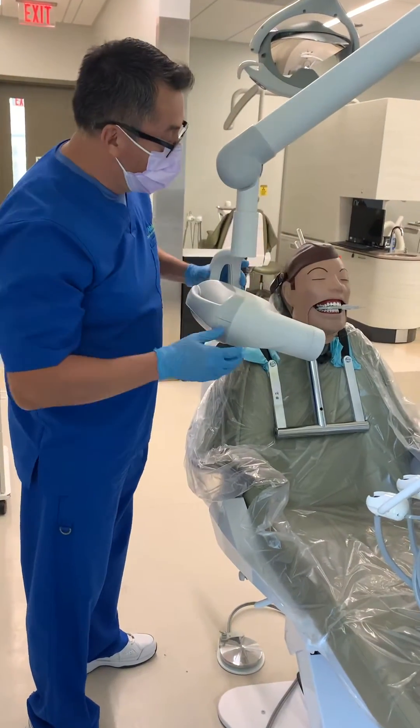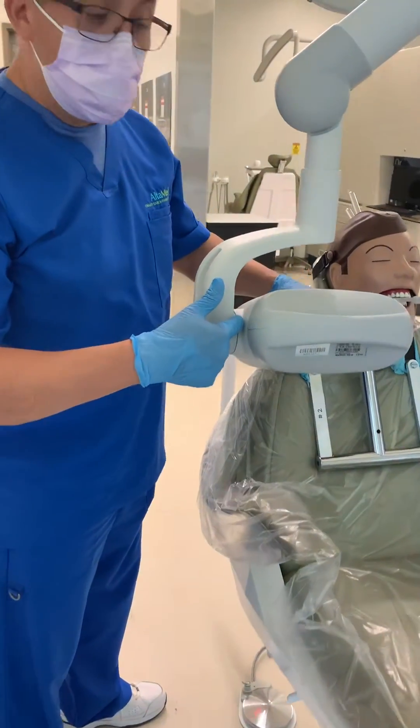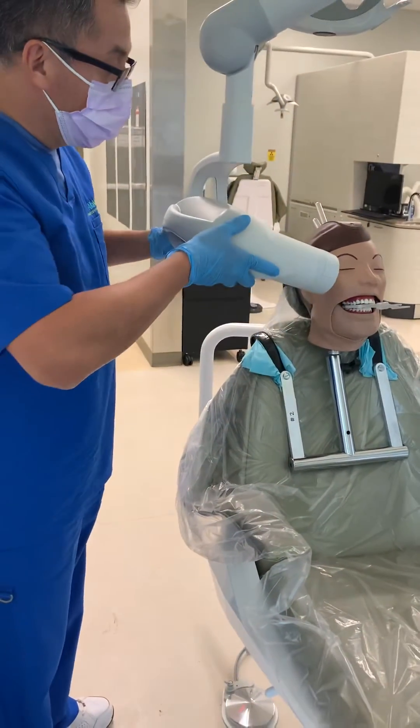I already placed back the film inside the patient's mouth. As a recap, we have 20 degrees set right here on the PID with the X-ray unit.